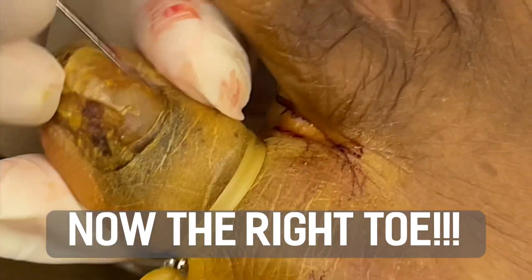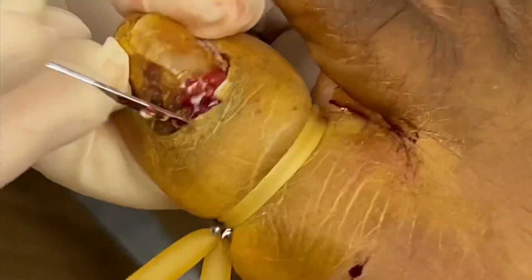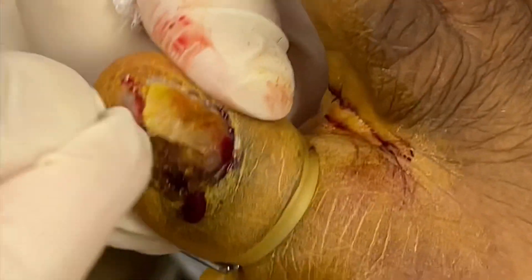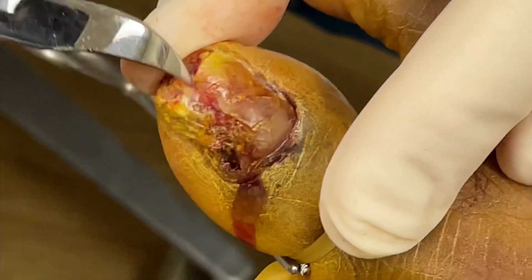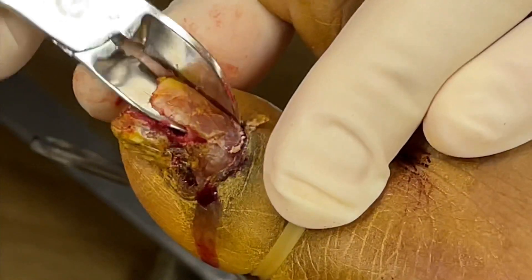We're working on the right toe now. Same thing — you're just freeing up the eponychium or cuticle from the nail plate so that you can loosen it without disrupting the skin or causing any tearing of the cuticle area. Then we go under the toenail, and you can see how deformed and fragmented the nail has become from the adhesives. We use a nail nipper to simply grab the toenail and work it loose from the underlying nail bed.